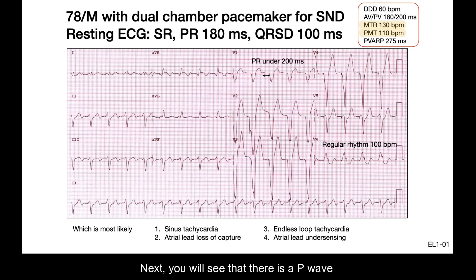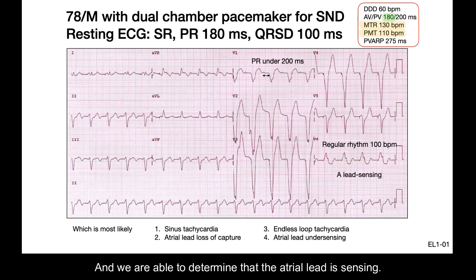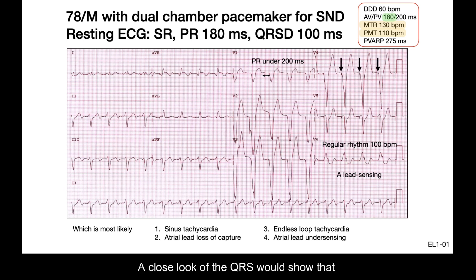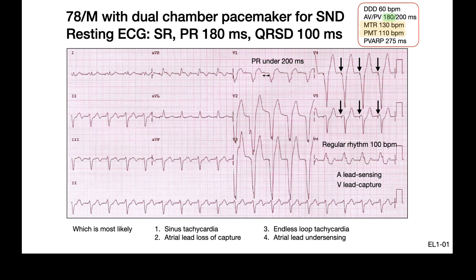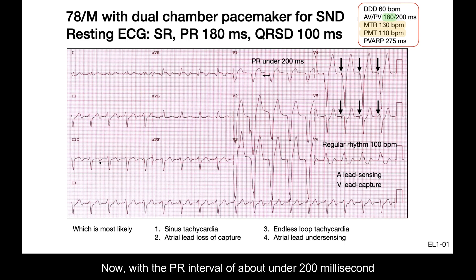Next, you will see that there is a P wave with a PR interval of less than 200 milliseconds, and we are able to determine that the atrial lead is sensing. A close look at the QRS would show that there is a pacing spike in front of every QRS, indicating the ventricular lead is capturing.